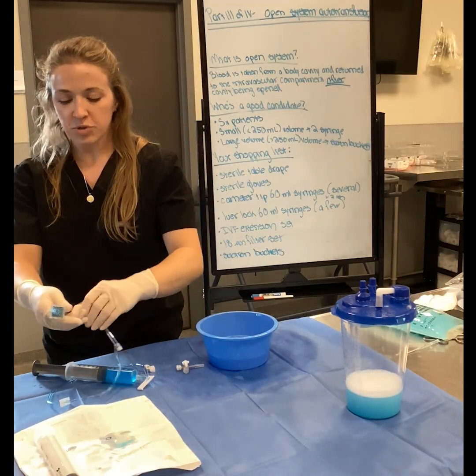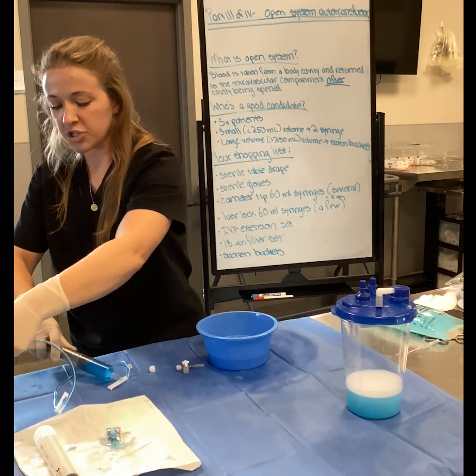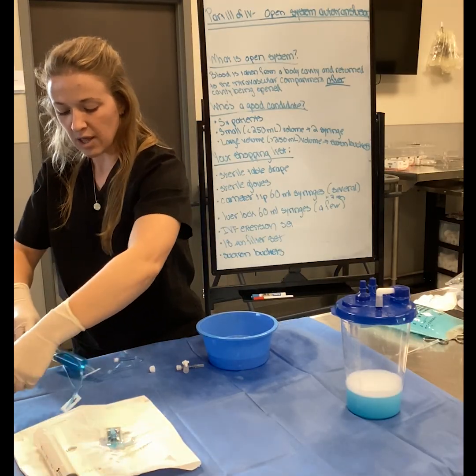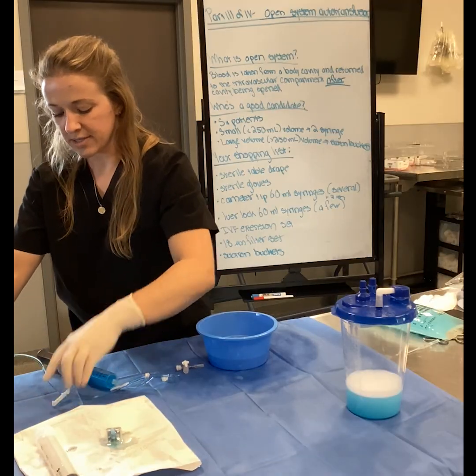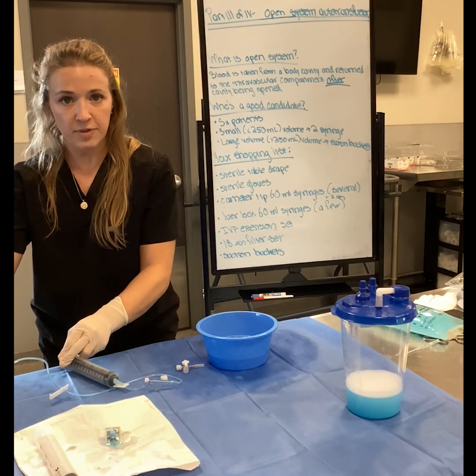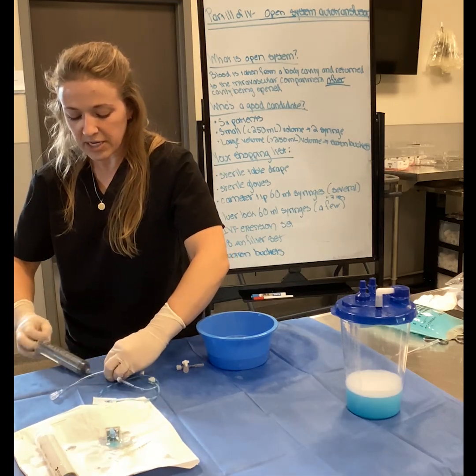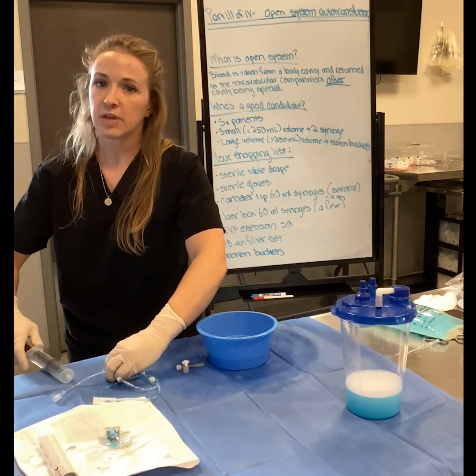So that is the 2-syringe technique. Just going to clean up a little bit here, and then we will move on to the use of suction buckets. So the use of suction buckets is a modification of the open system autotransfusion. So the suction bucket is a great idea when you have a very big patient.